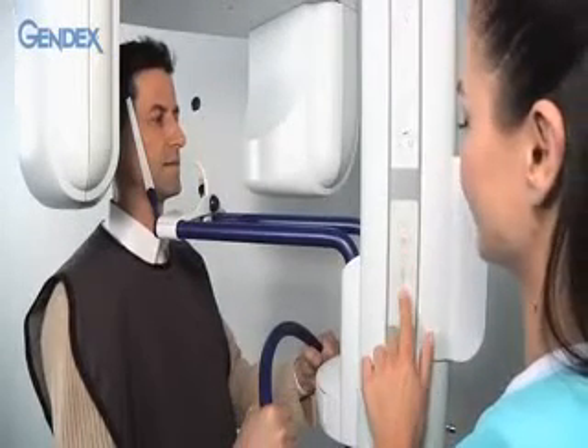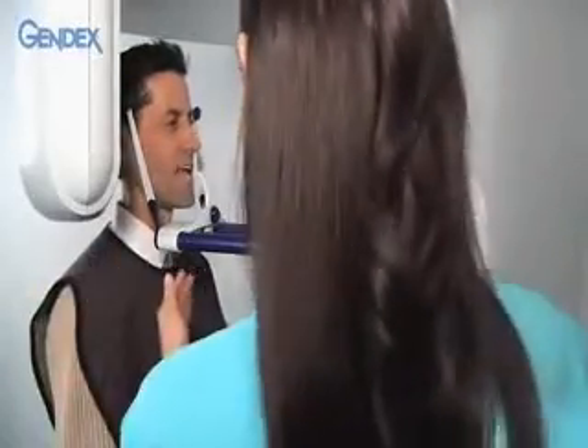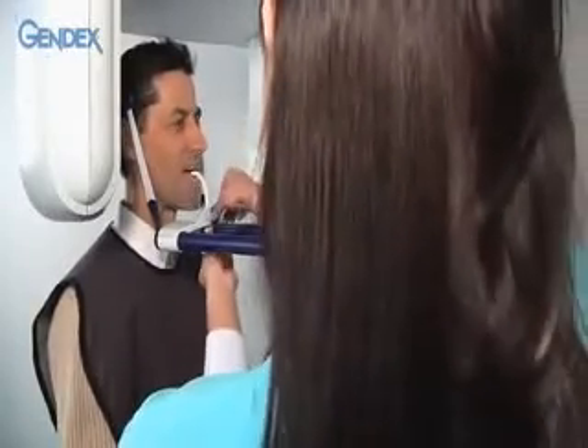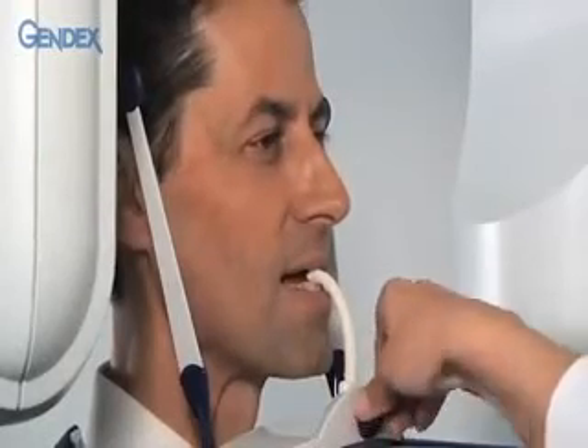Raise and lower the gantry as needed so that the bite guide is at the level of the mouth. Then assist with placing his upper and lower teeth into the groove of the bite guide at the midline. Raise or lower the bite guide as needed and then tighten it firmly in place with the appropriate knob.